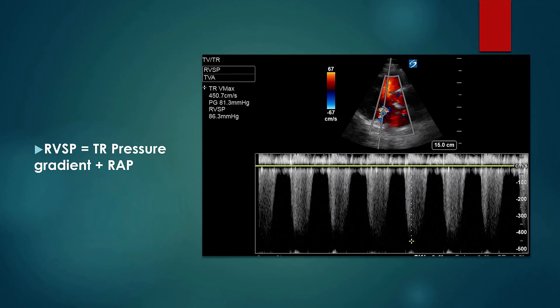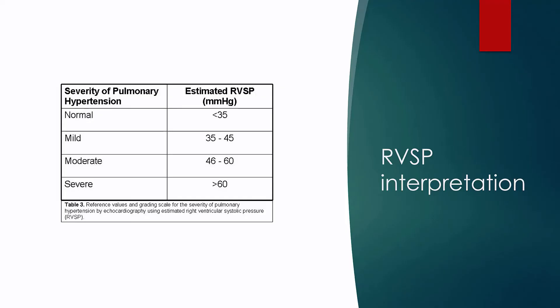Here is an example of a continuous wave Doppler through a tricuspid regurgitant jet. The maximal velocity of this TR jet is approximately 4.5 meters per second — well above our 3.4 threshold. This generates a pressure gradient of 81, and adding an estimated right atrial pressure of 5 gives an RVSP of 86, making it highly probable that this patient has pulmonary hypertension. For reference, using older severity categorizations, RVSPs of 45 and lower are far less significant than those greater than this; an RVSP of 86 makes severe pulmonary hypertension quite likely.